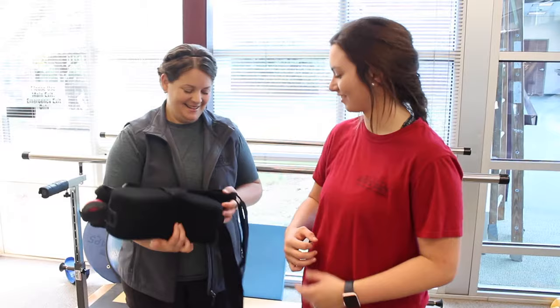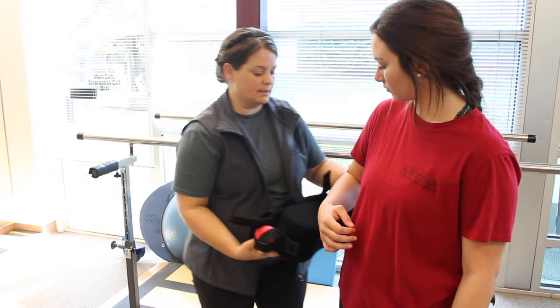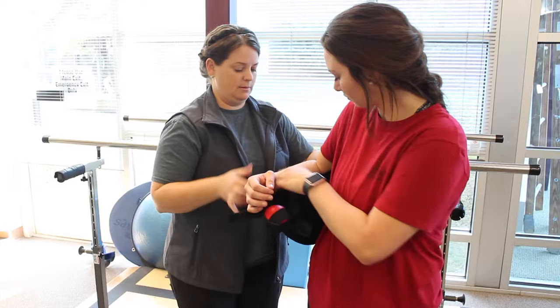Step number one is to take the abduction pillow and place it at the side of your torso. Slide your elbow into the back of the sling and let your forearm rest comfortably on the abduction pillow.